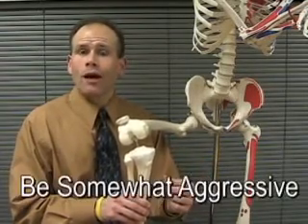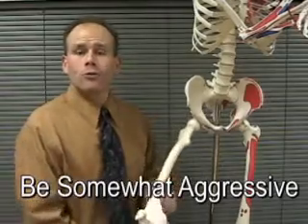You'll try to minimize that. You'll try to be quick but accurate. But the better job that you do of pulling that subcutaneous fat away, the more accurate the measurement is going to be, or the better way to explain it is the skinnier they're going to look if you get a better measurement. So again, we have a vertical fold on the calf. We also have the vertical fold on the anterior thigh.